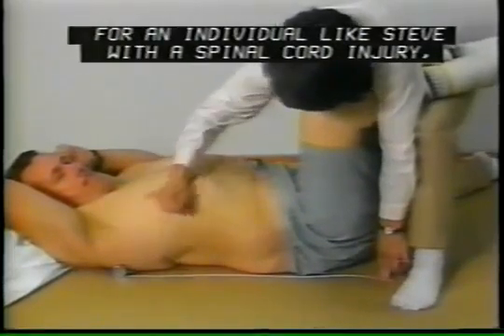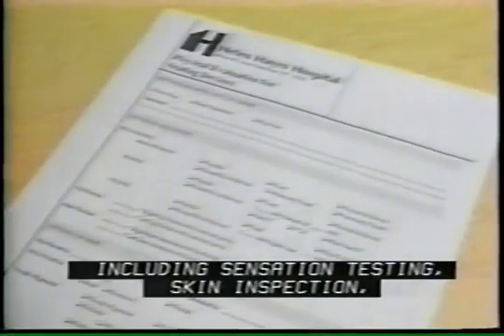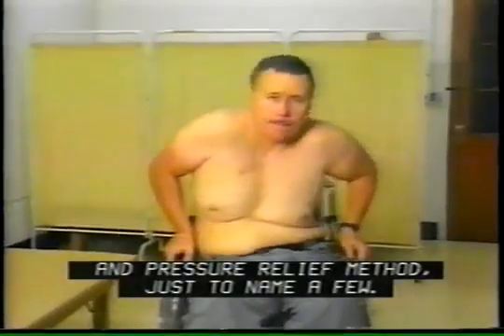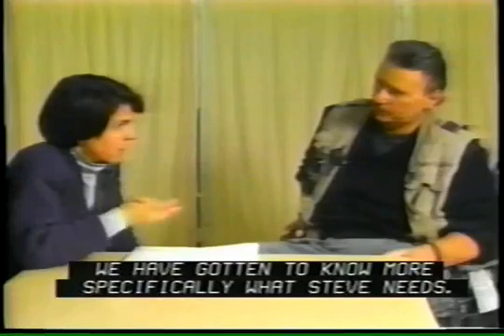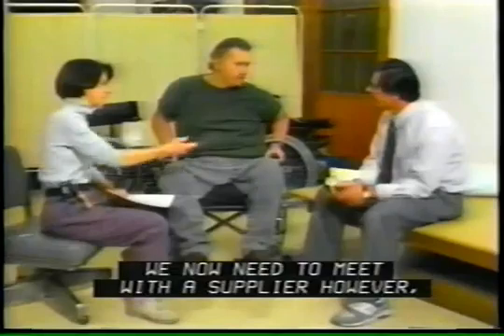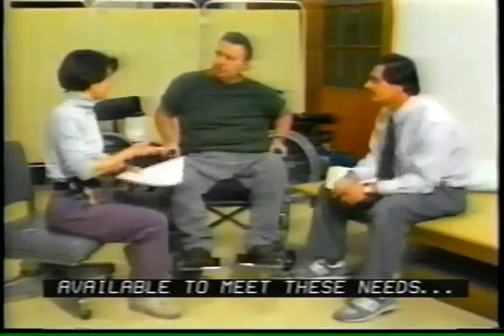For an individual like Steve with a spinal cord injury, a full evaluation would involve many other tests, including sensation testing, skin inspection, transfer technique, mobility skills, and pressure relief method, just to name a few. By collecting all of this information, we have gotten to know more specifically what Steve needs. We now need to meet with a supplier, however, to find out the product options available to meet these needs. Some of the commercial options that we hope to put into your chair to achieve some of your goals.